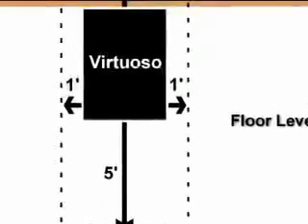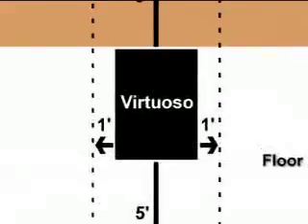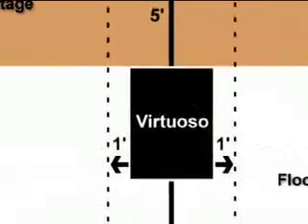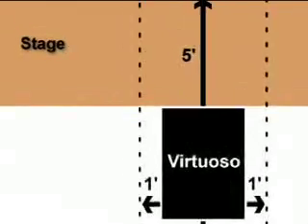Check the selected location for any obstruction that would hamper the operation of the lift. Additionally, make sure that there is a minimum clear space of 5 feet at the upper landing. Do not set up the unit in any location that does not allow for these minimum space requirements, as this could create an unsafe condition for users of the lift.